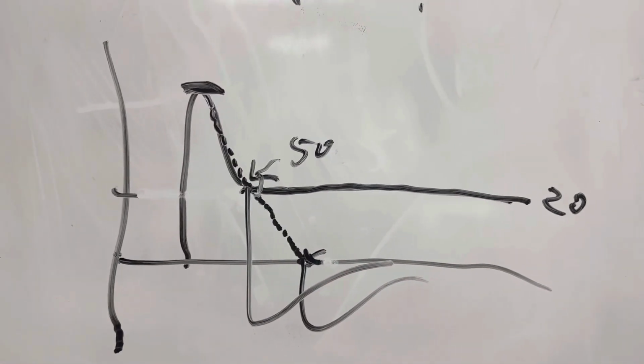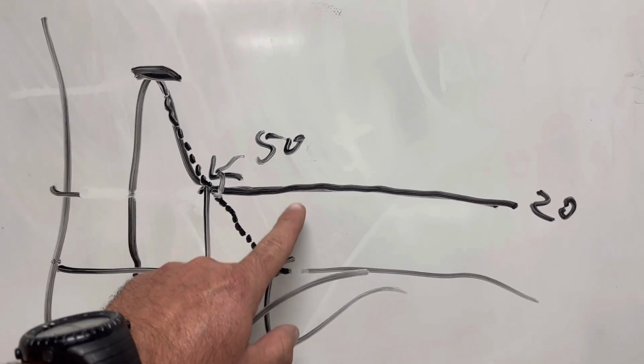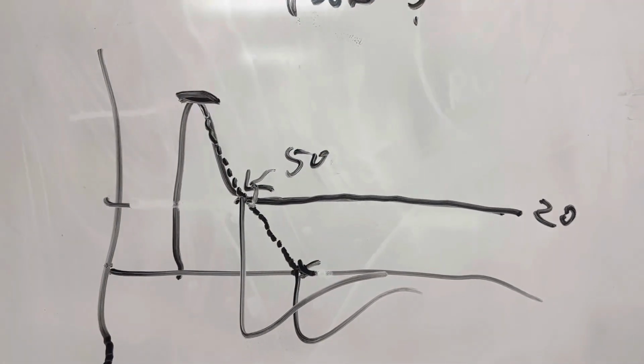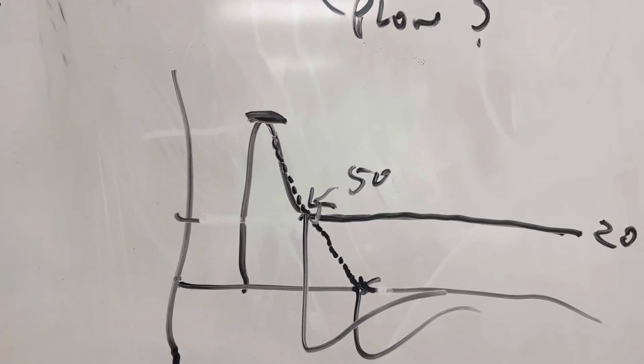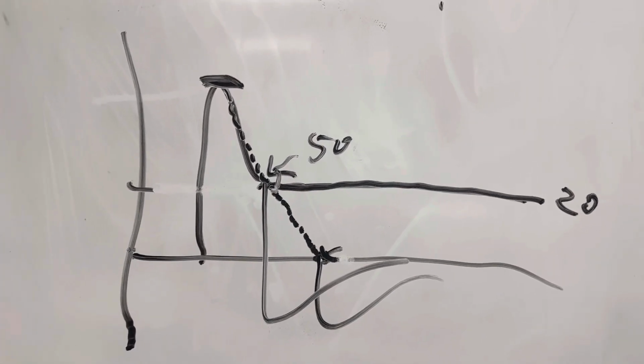Well, we don't want that to happen, right? Because that means at some point the patient is going to exhale on his own, and he'll start pushing through this, which is still up at your high pressure support level, and essentially he'll be exhaling through a high PEEP. So we want to identify when this waveform is occurring, and the first thing we want to do is talk to the physician about fixing this leak.